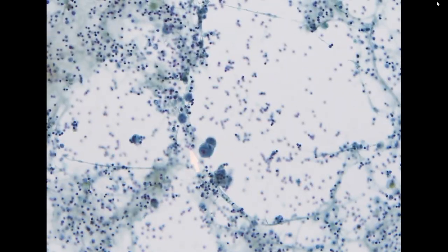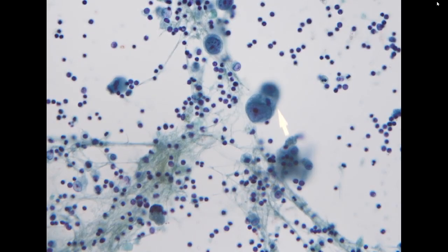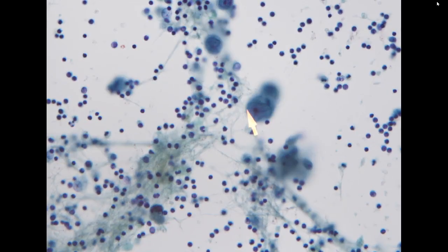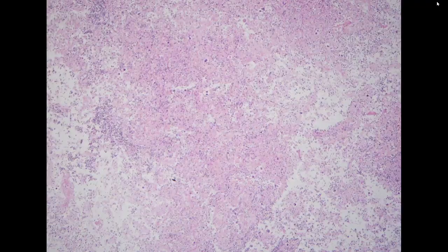We also have a new case. This is a primary pleural effusion. The patient is a new patient. This is his first specimen in our hospital. And you can see also poorly differentiated adenocarcinoma features: vesicular chromatin, prominent nucleoli, and bubbly cytoplasm, with clusters in glandular-like structures. So we will do TTF1 on the cell block specimen.